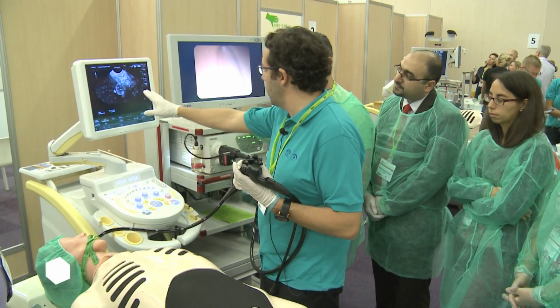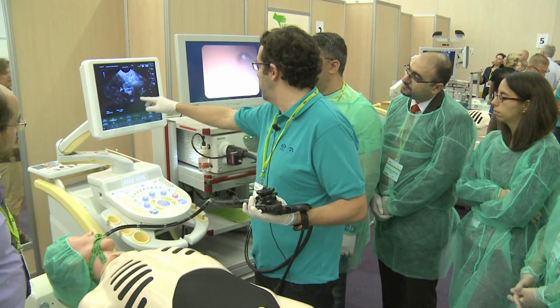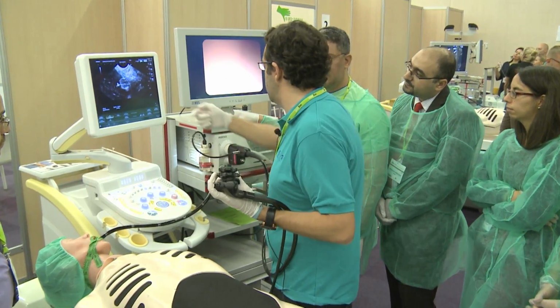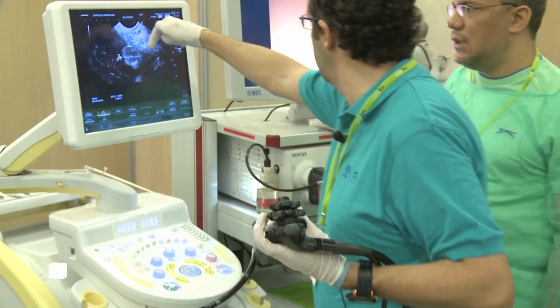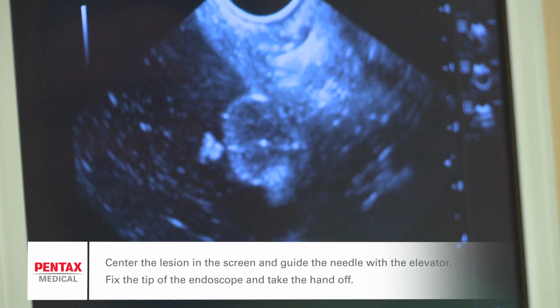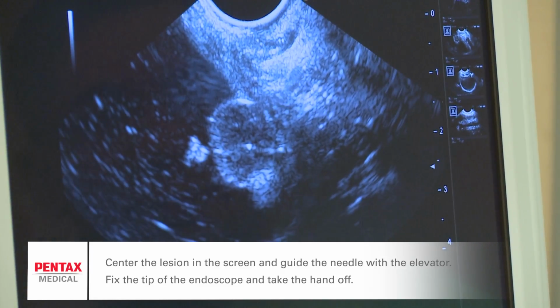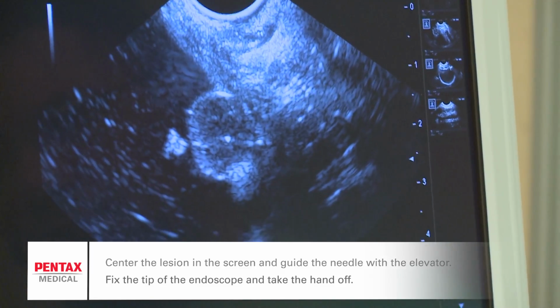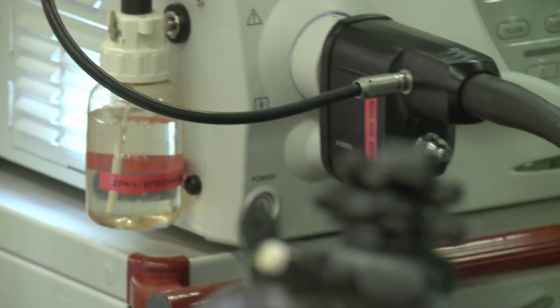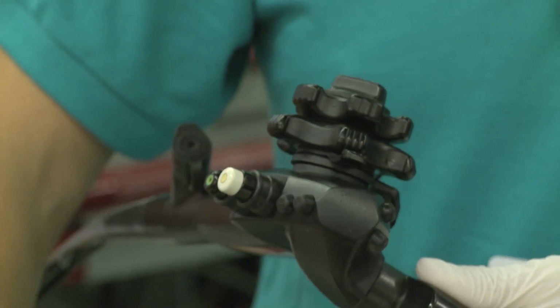Next step. I've already found what I want to puncture, so always try to put the lesion in the middle of the screen. However, it doesn't matter so much because we are going to see the needle and be able to direct it with the elevator. But the first point is to fix the tip of the scope. So now we can almost take the hand out and we always have the lesion stable in the same position.